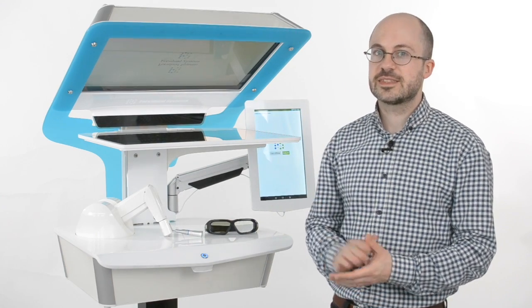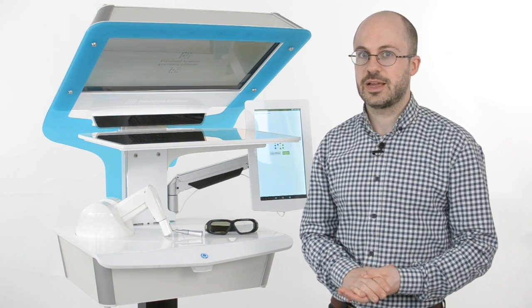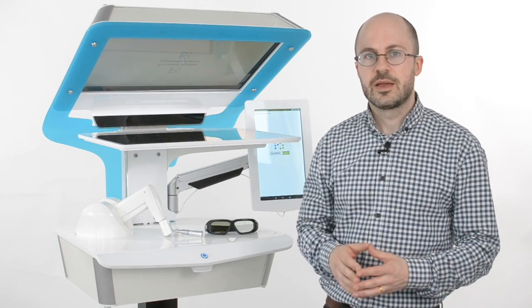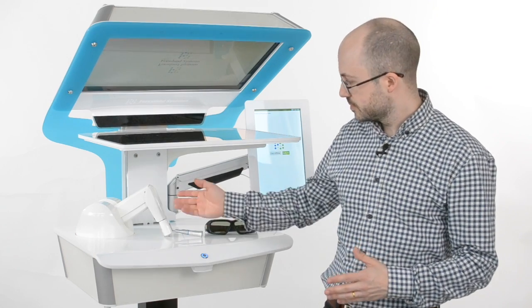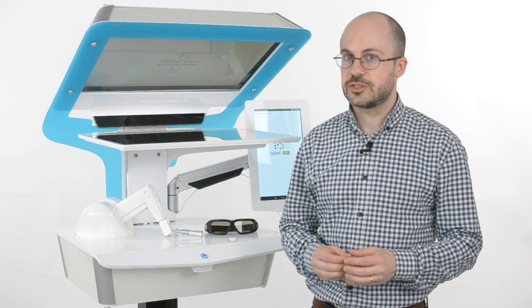My name is Jonas Forslund and I'm going to demonstrate the Cobra Oral Surgery Simulator. This simulator is designed for practicing oral surgery procedures in a safe virtual environment. The key technologies that enable this are a large 3D display where you can see a realistic representation of a virtual patient, and a haptic device with which you can feel and interact with the patient using virtual instruments.